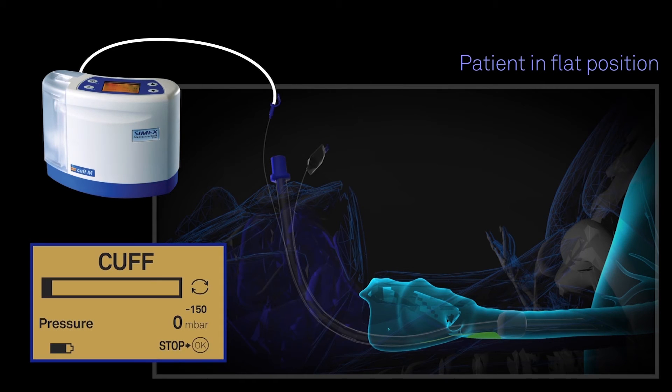When the SIMEX automated aspiration system is connected to the subglottic endotracheal tube, it can be programmed and tailored to each patient's condition.